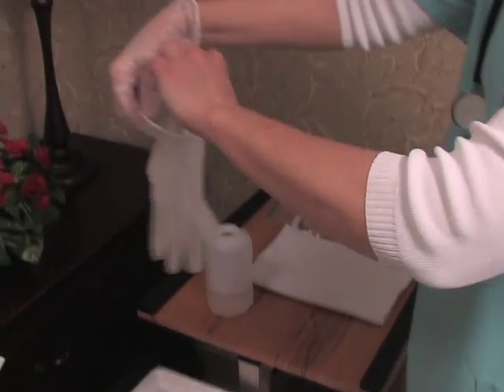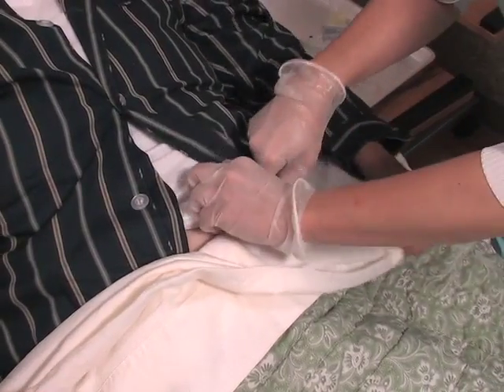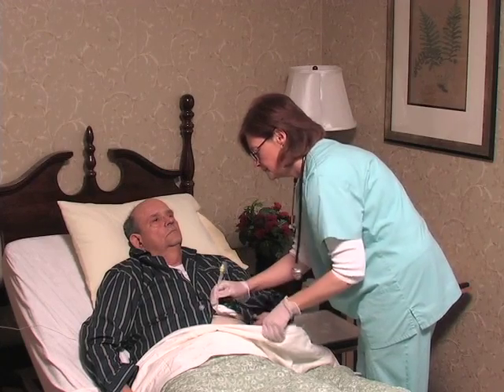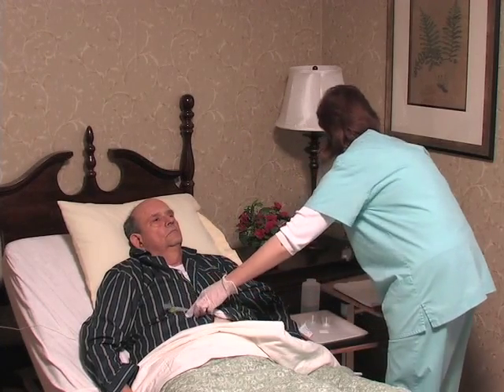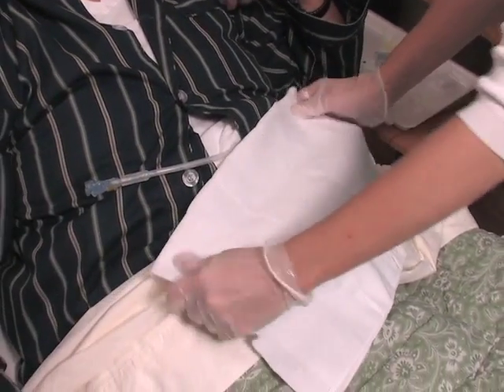Maintaining infection control practices, the nurse puts on gloves. The nurse exposes only the area of the body required for this procedure and protects Mr. Hansen's linen and clothing by placing a linen saver just under his tube site.